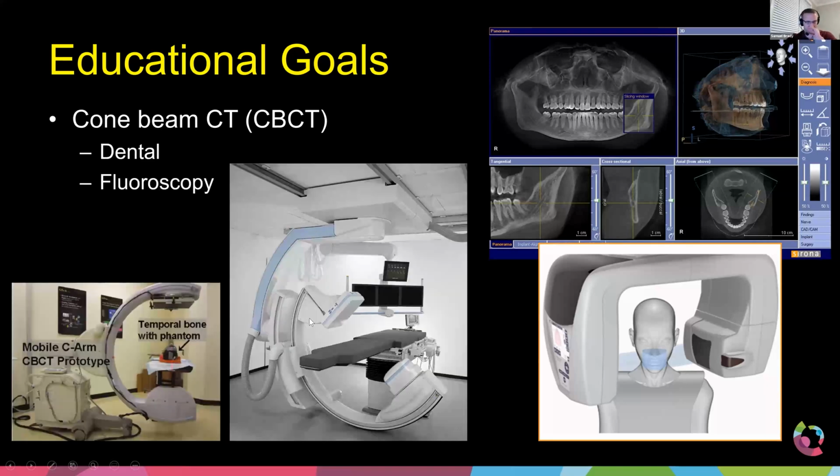And the other one, of course, as I introduced in the previous slide, is used typically in interventional fluoroscopy. So now we're doing typical procedures such as stents, grafts, biopsies, maybe needle localizations. The most common are these C-arm units that are going to be mounted either to the ceiling or to the floor, and they'll be found in an interventional suite.